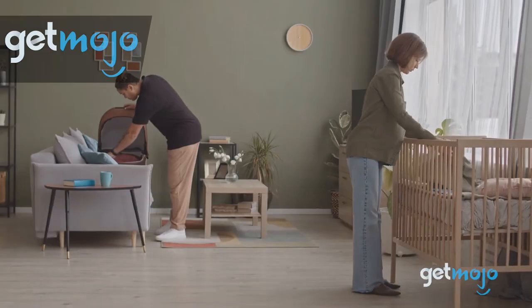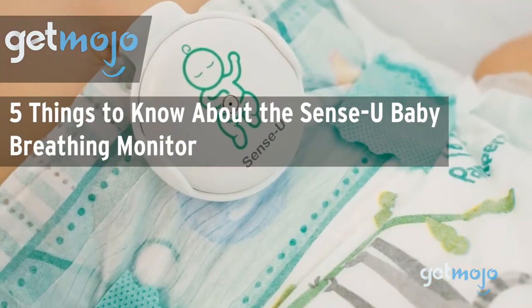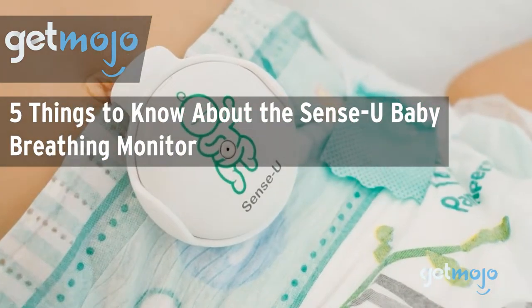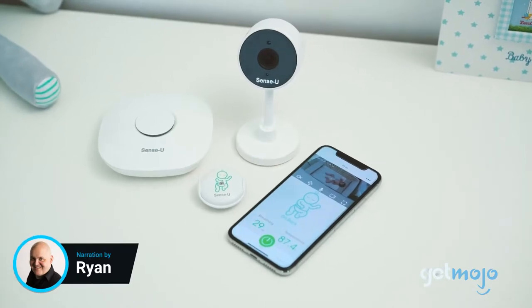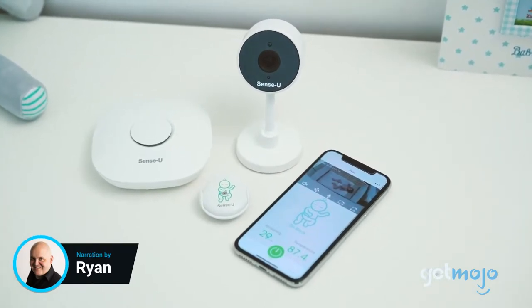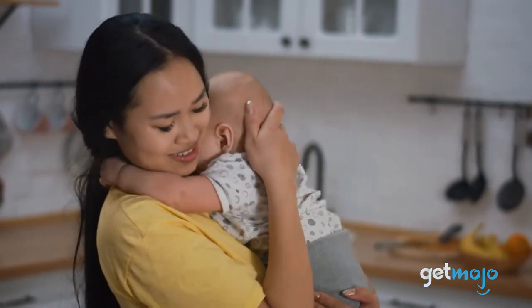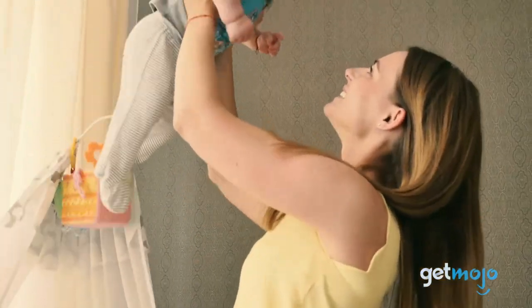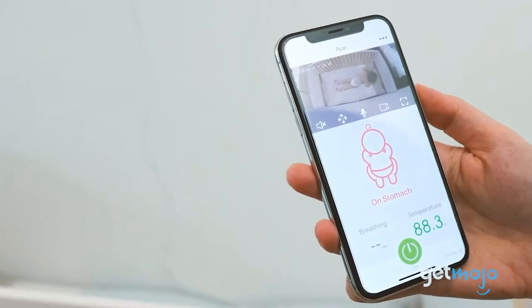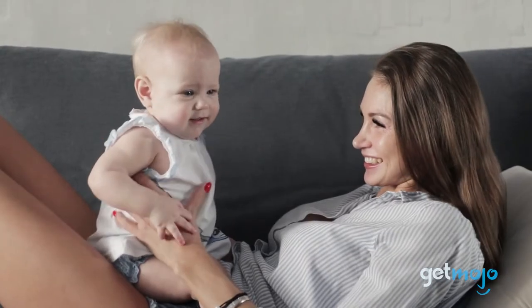Welcome to Gitmojo, where we do the research so you don't have to. In this video, we're giving you 5 things to know about the Sensu Baby Breathing Monitor before buying. This clever little gadget from Sensu has been carefully engineered to put parents' minds at ease while their bundle of joy is asleep. Metrics like movement, heart rate, ambient and skin temperature are useful for spotting irregularities as they arise, and this award-winning device measures all that and more. Here are 5 things you should know about it before buying.